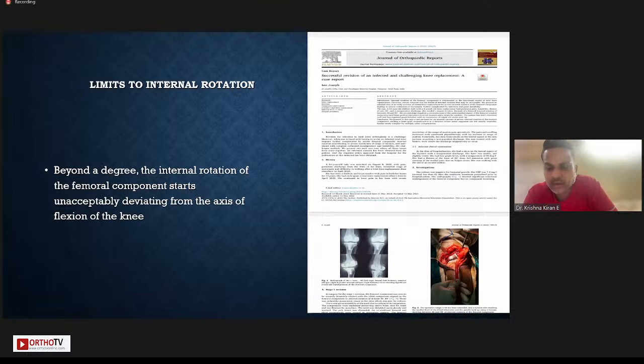So what we did was, we had the same doubt, and we looked at patients who were undergoing robotic surgery with a mechanical plan, and we saw what was the difference in tightness on the medial and lateral sides. The default plan was to make the lateral side in a varus knee 0-0 in flexion and extension and see how much is the medial tightness. What we noticed was we could significantly bring down the medial tightness without doing soft tissue releases by minor adjustments in the sagittal, coronal and rotational position of the implant. So it is a much more elegant way of doing the surgeries.